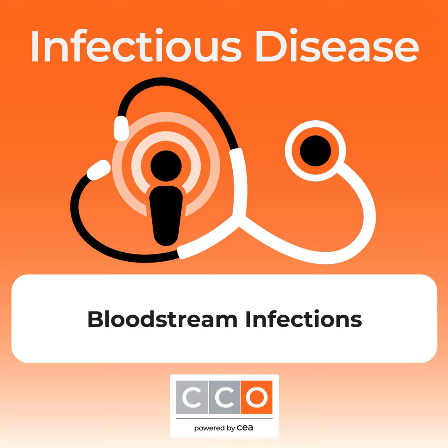Ideally, with these rapid tests, you want them done in real time. You want the information coming out as quickly as possible, but doing it in batches can actually really improve efficiency for the lab and also be timed with when you're able to communicate those results with an expert to your team. Would you have them done at a centralized lab or a decentralized lab if your main lab is not on site? To steward these tests, we generally run them just on the first positive blood culture versus doing them on every single blood culture, unless the gram stain is indicating that there might be something different in that second bottle. But that's a good way to make sure we're being efficient and cognizant of how we use these tests.